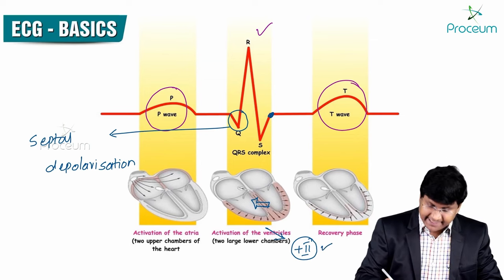So you have placed the patient. You have placed the electrodes. Surrounding him, you have placed many electrical appliances which will be generating potential. Pulse oximeter is there. Defibrillator is there. 2-3 mobile phones are there. In such a case, when the electrodes are picking up the electrical activity of surrounding objects, then you will get these particular thick lines. Is that clear? Next. And this is again an artifact. There is no problem in the patient, okay?